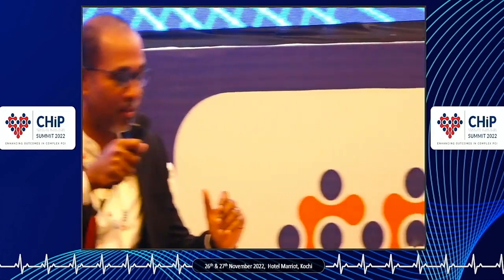Again, Dr. Davidson, thank you for the question. It depends on the particular case. For elective high-risk PCI, obviously, Impella would be more comfortable for myself, for the team and for the patient. We're not talking about long-term outcomes, we're talking about the current case in the cath lab, to get the patient out alive with more likely complete revascularization, if indicated.